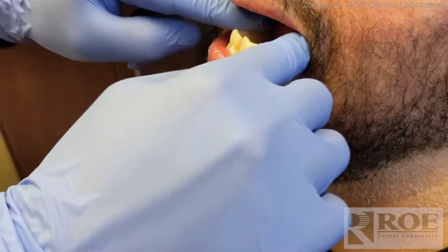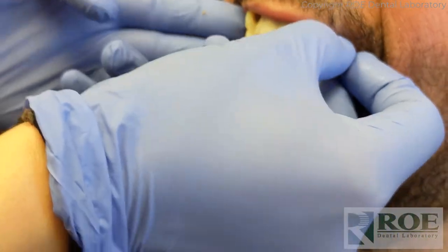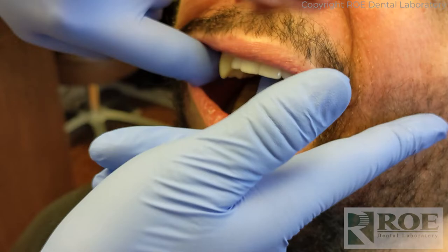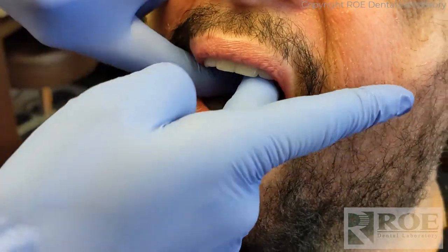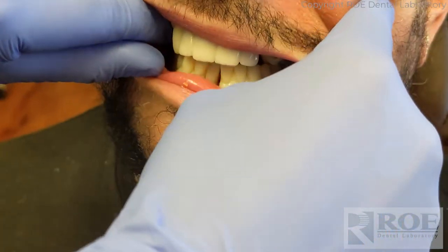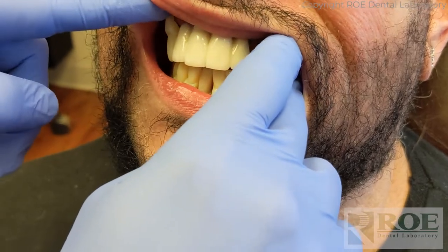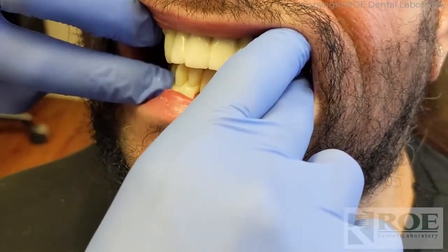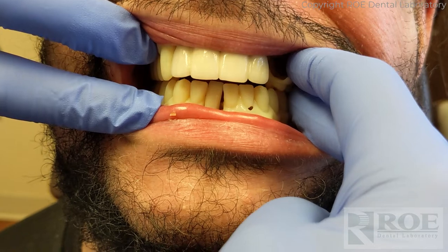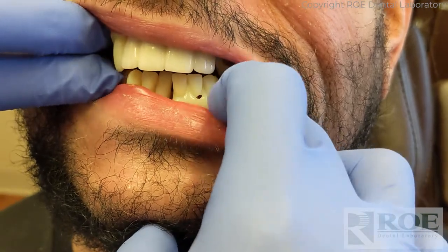All right, they seat well. Now we'll insert both — sorry, mouthful of plastic and my fingers. Once they're seated it'll be a little more comfortable. The idea here is that with both of them in, we want you to be able to bite down. We want to make sure the occlusion is good. With a lot of these we'd normally make metal clasps, but we can't on these because there aren't enough teeth to hold on to. So we're going to make sure that when they're seated and when you're biting down, they're not rocking at all — that they have a nice full seat.